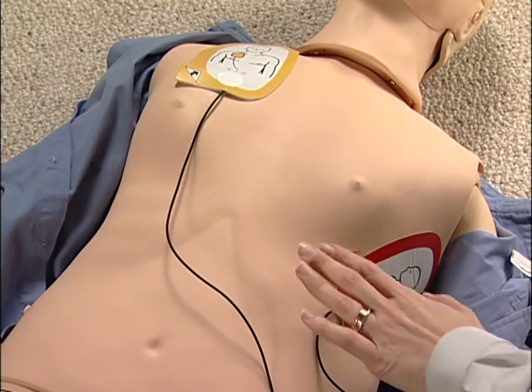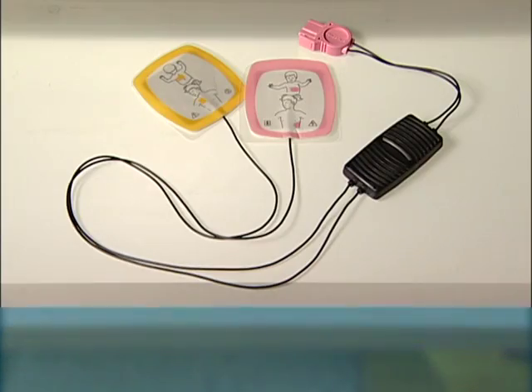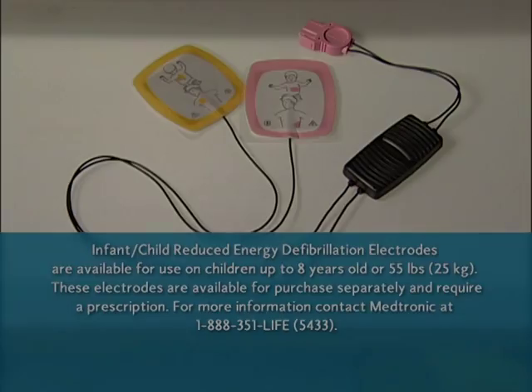These electrodes, the ones that come with the LifePAK AED, are for use on people over 8 years old. There are special electrode pads that are for use with children under 8 years old. If you might need those pads, you should contact Medtronic for more information.